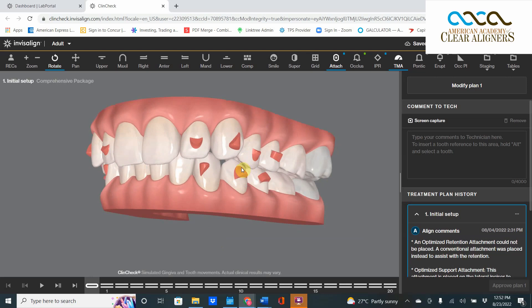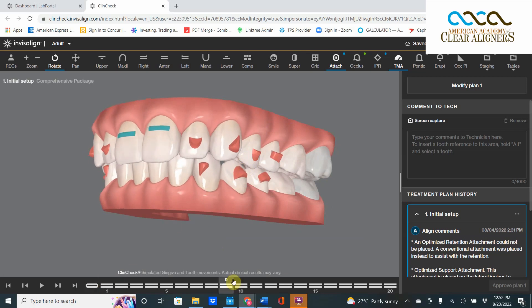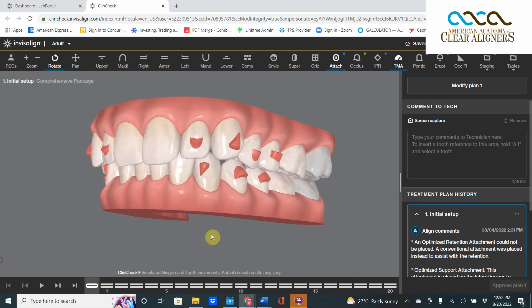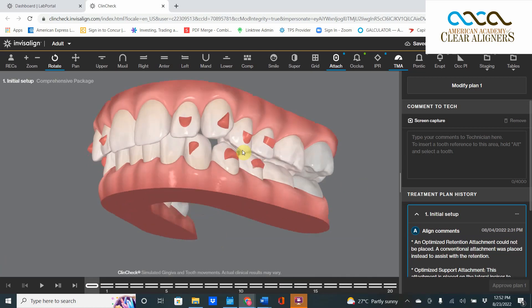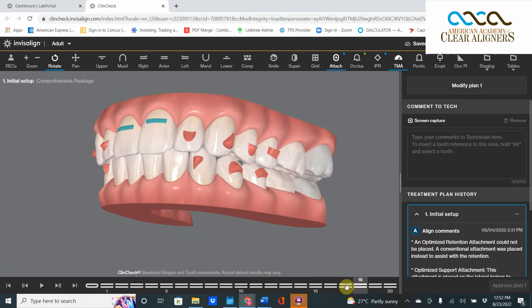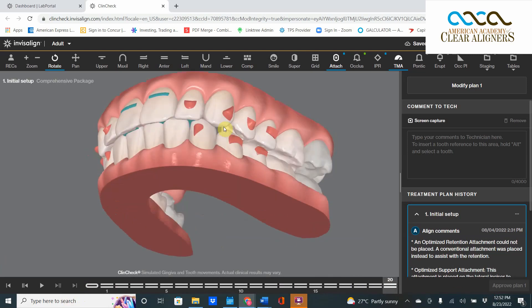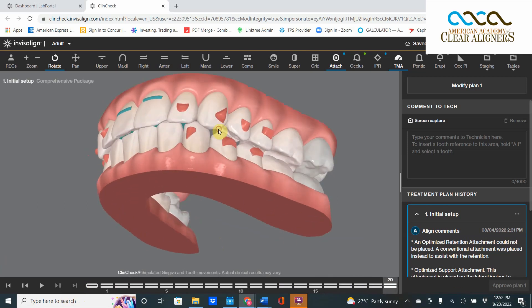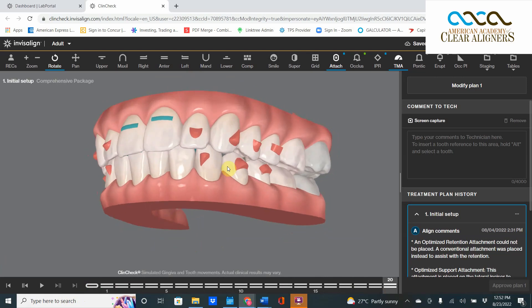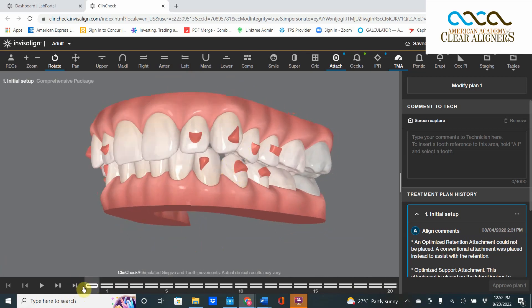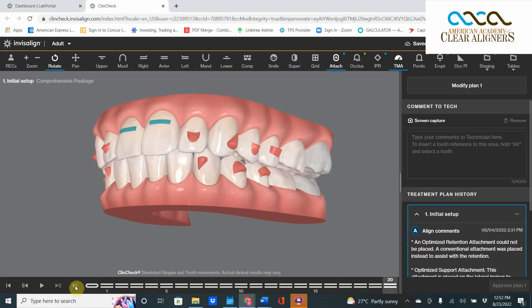Because this canine is rotating in more, this premolar starts to get out of the way so that that guy could come in. And that's nice, the premolar gets to rotate, that's nice, but because of that, this ends up being an open-stage occlusion. That is the problem. The end-stage occlusion on the premolar was worse than the original.